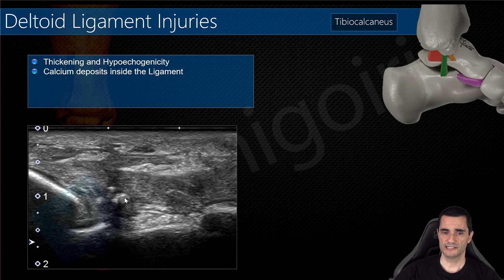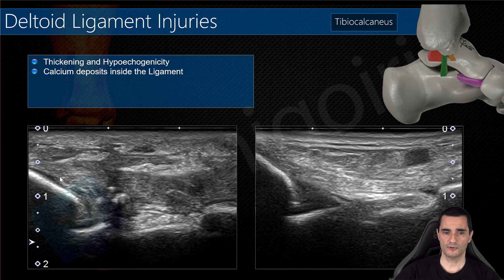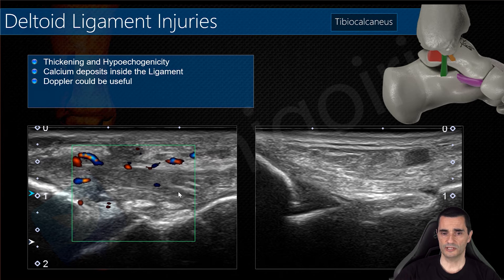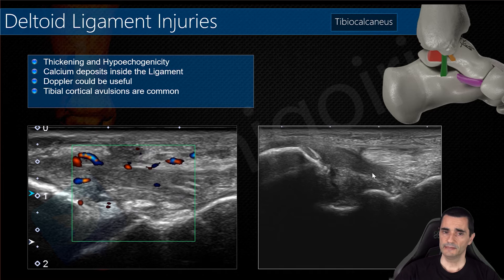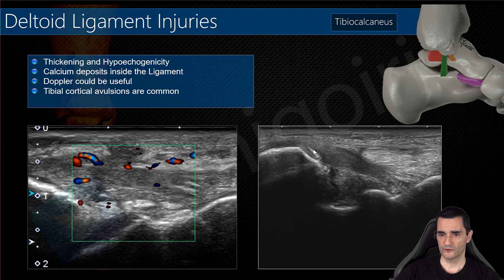You can find calcium deposits inside the ligament as a metaplasia of the injured ligament. This is another example of the hypoechoic thickened ligament compared to the normal side, in this case with calcium deposits inside the ligament and vascularization on Doppler. Tibial cortical avulsions are very common — always check the insertion. Here between the tibia and calcaneus you can see the thickening of the ligament and the avulsion, alongside a possible tear inside the posterior tibiotelar ligament.